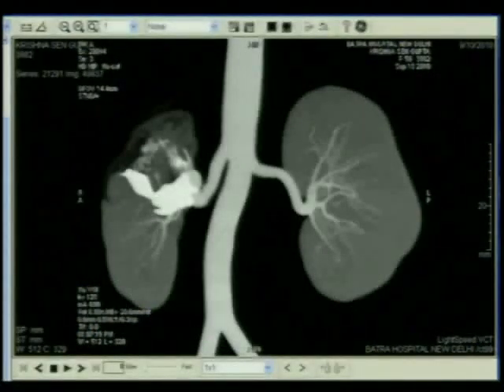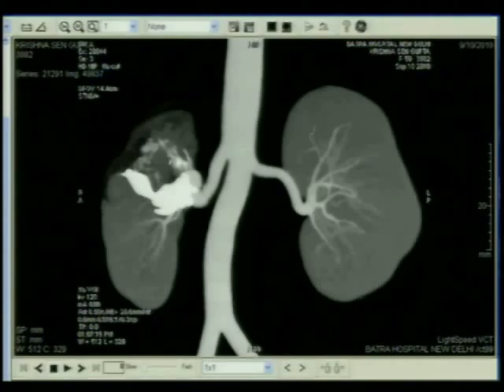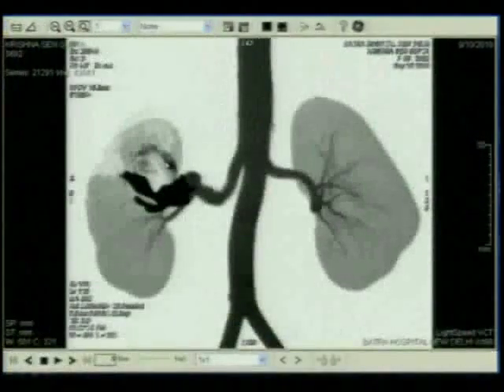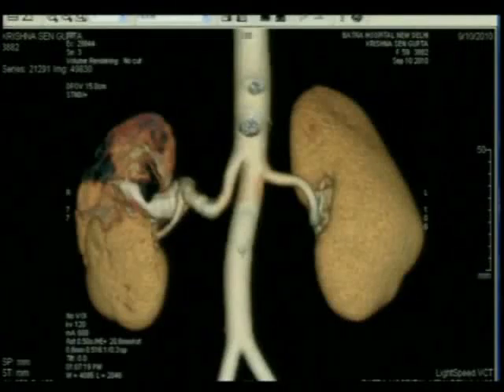Yeah, this is the CT angio, so this is the vascular plug, and the vascularity of the kidney was totally blocked. Done 24 hours later, same thing. This is a volume rendered image. So the patient developed some pain in the right flank, which disappeared in 2 days' time without any bruit. Aneurysm with AV fistula of the renal artery can be selectively blocked by an Amplatzer vascular plug if it is suitable like this.